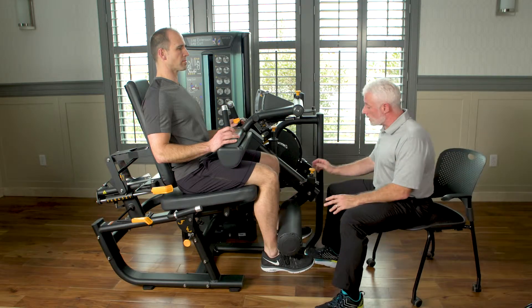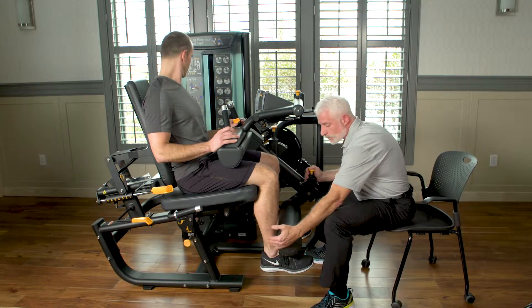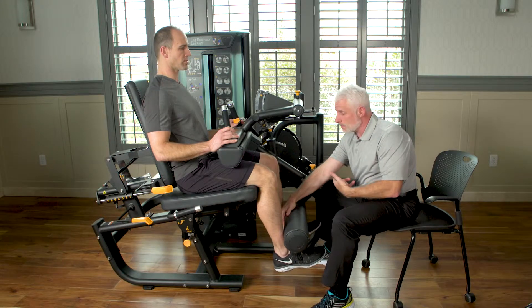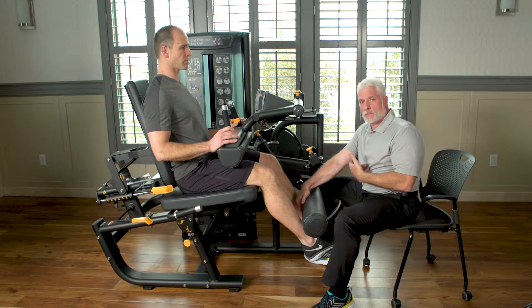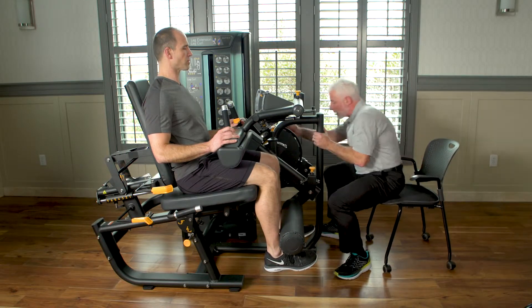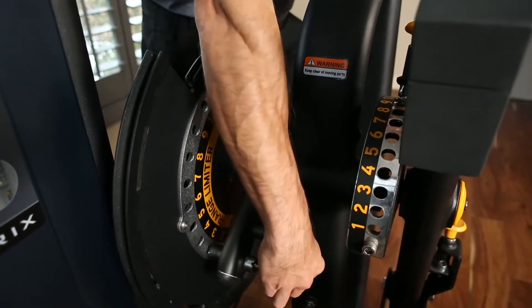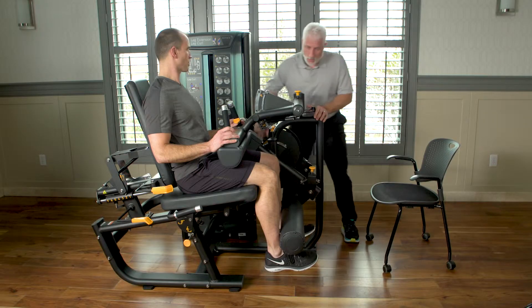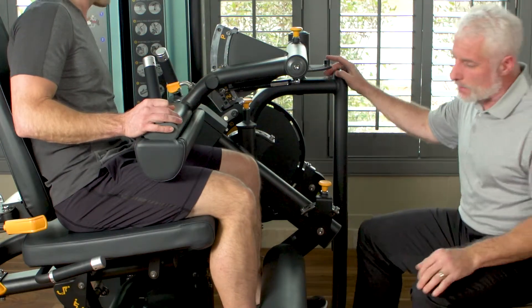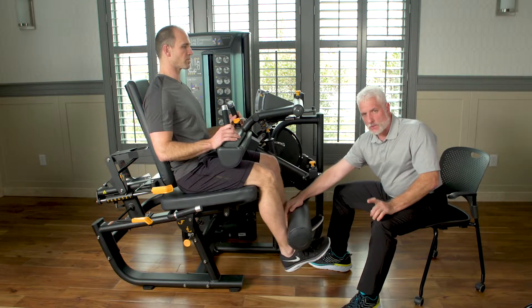With this machine, whatever way you choose or the patient chooses, he's going to push out into the pad to engage the quad and then bring it up to a set level. If I want to range limit him, I can come over here and range limit him to whatever level I need. So we're going to protect the graft — he'll work the quad but not stretch the graft.